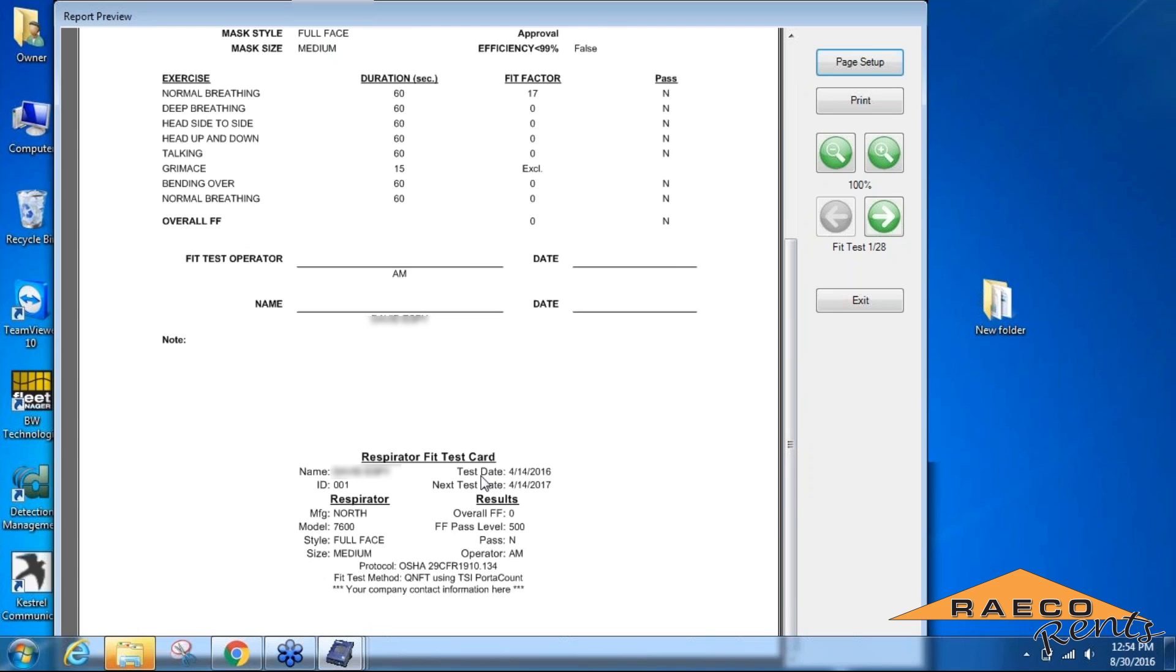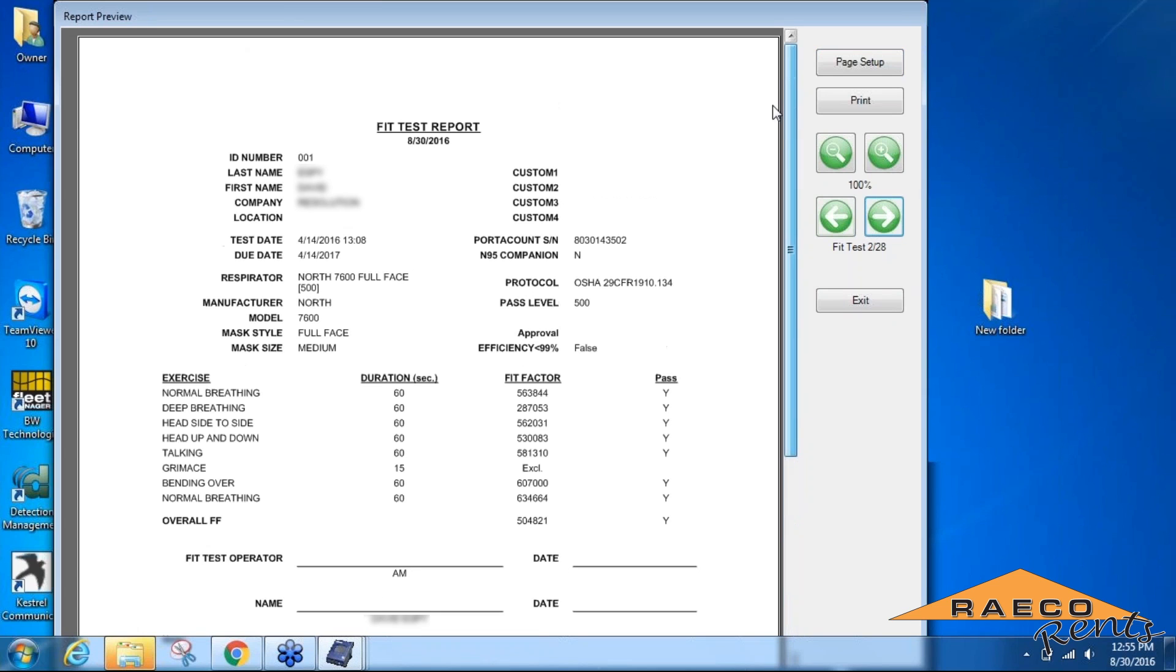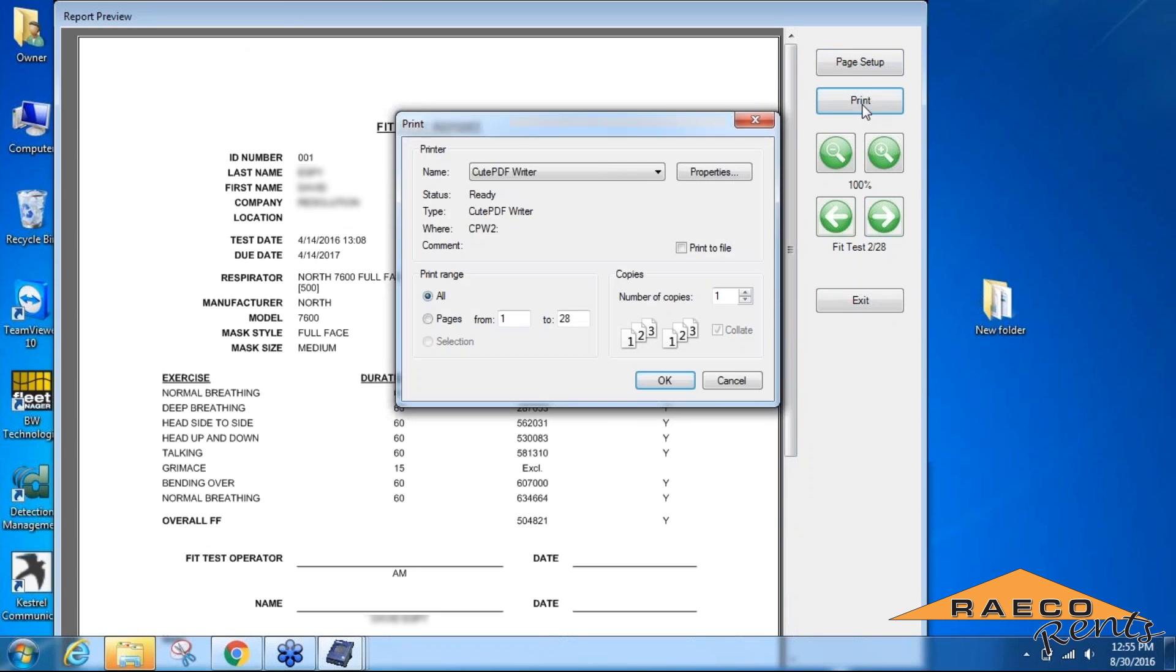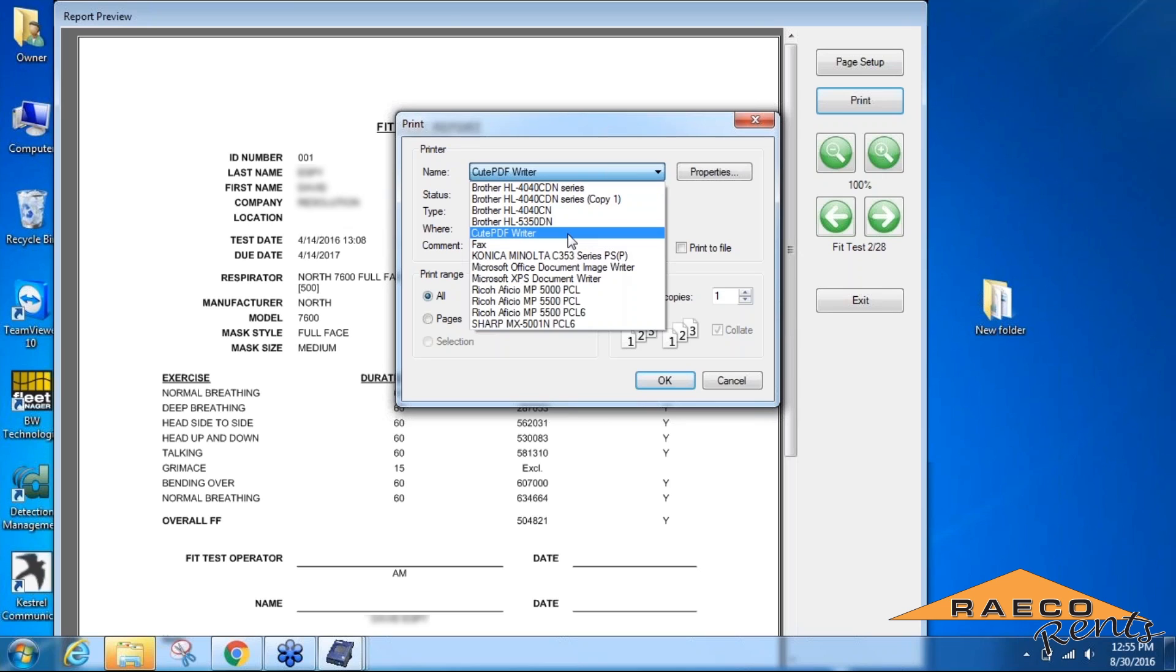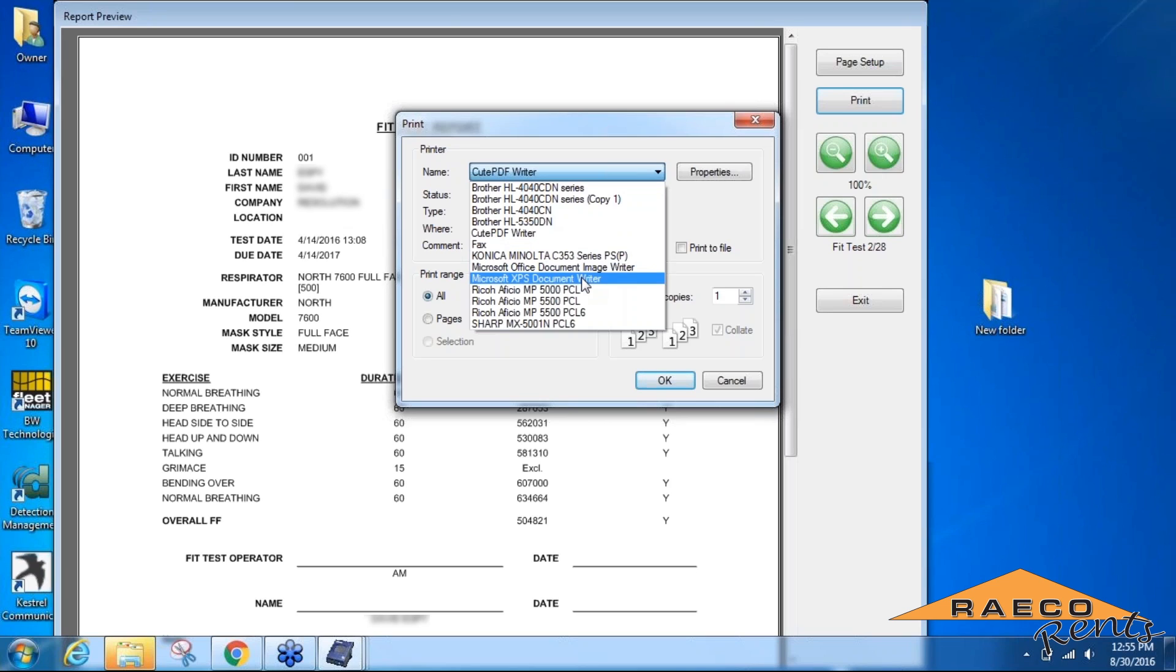From here, you can either print out these reports, or if you prefer to save it electronically, you can choose the PDF writer that's on your computer, either through a PDF writer or the Microsoft XPS Document Writer.